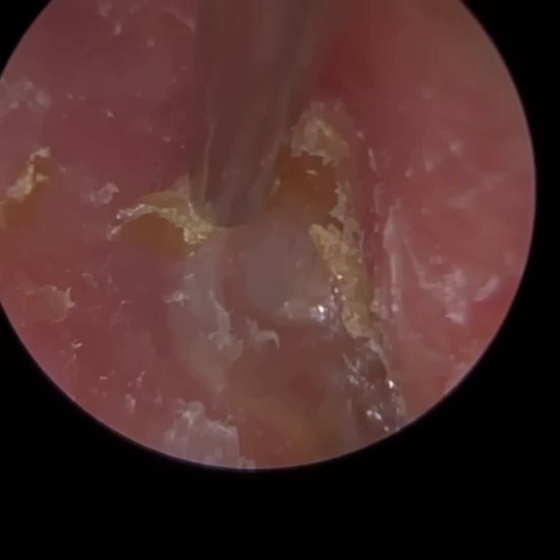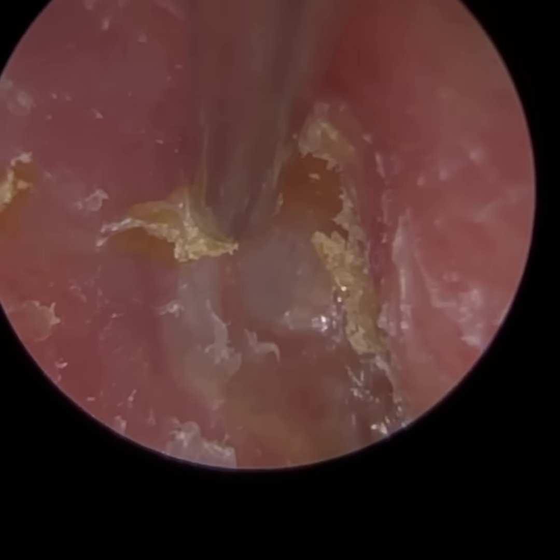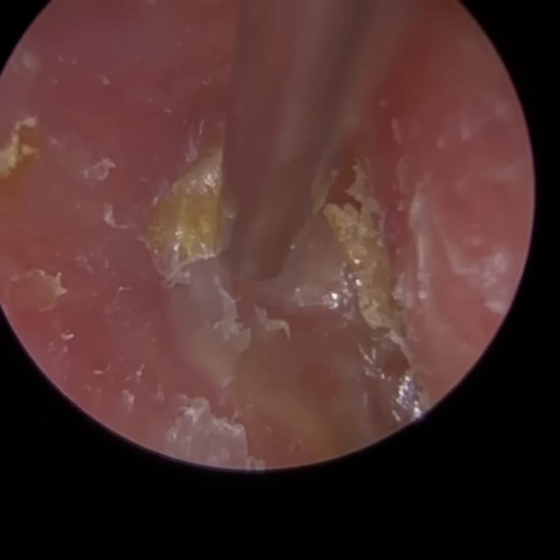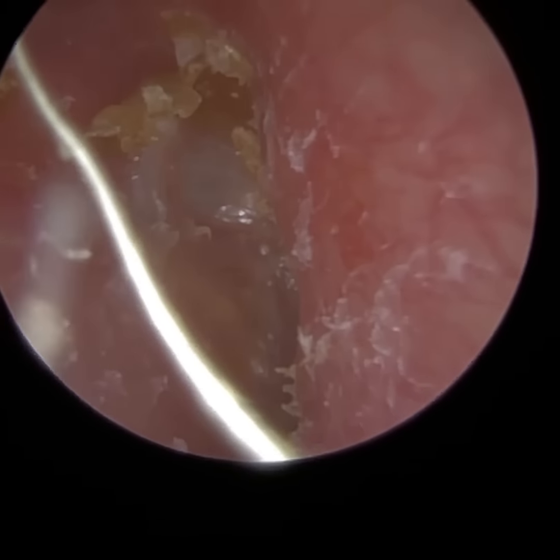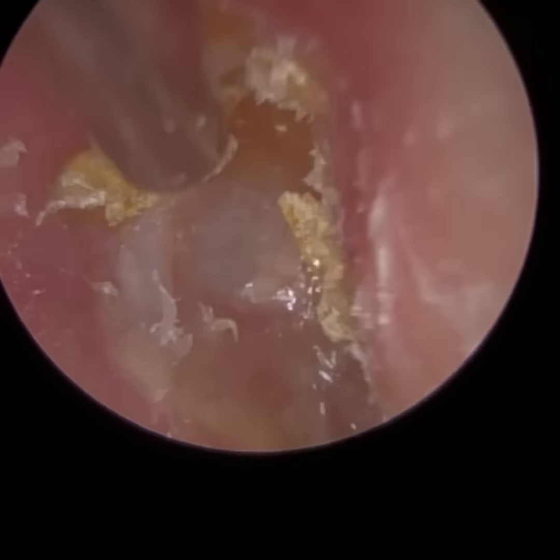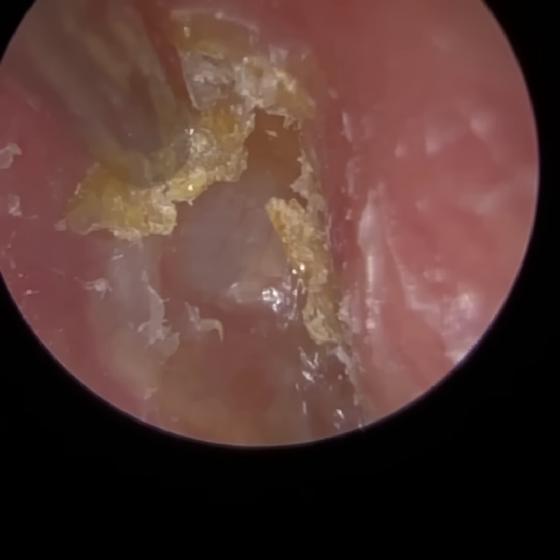Now that could be due to the patient's mastoiditis, because the mastoid bone is in that position. It's behind that bone there. That's the temporal bone, and the mastoid bone sits behind that. So if that mastoid bone is severely inflamed, it could potentially be pushing the temporal bone forwards. Or it could just be the patient was born like that. It just had a bulging posterior canal wall.